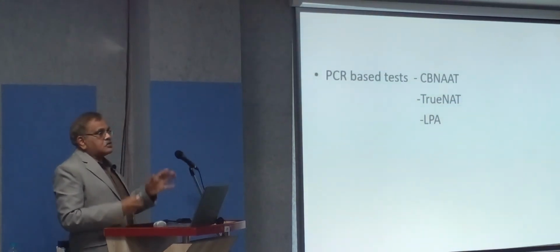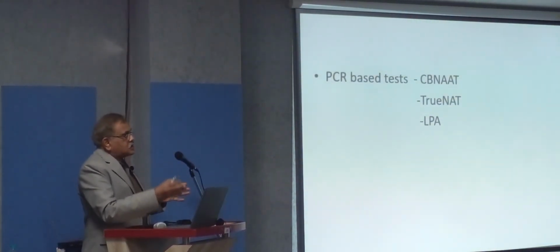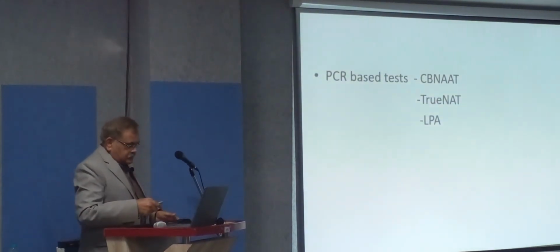Simultaneously, you can detect that it is Mycobacterium and whether it is resistant to rifampicin or not.